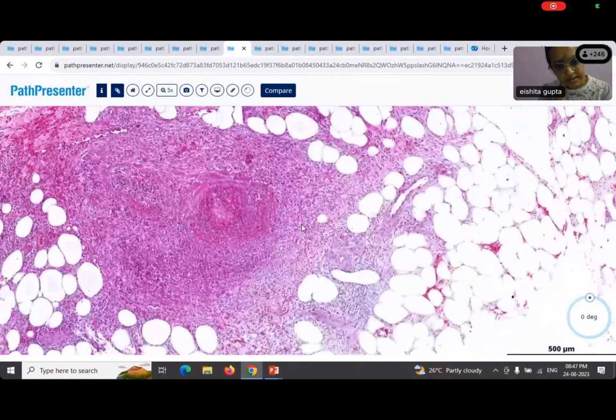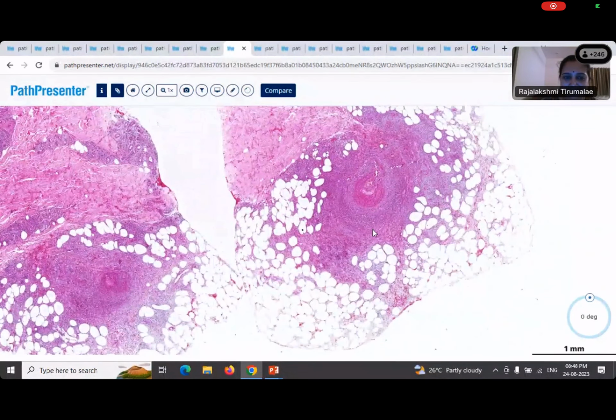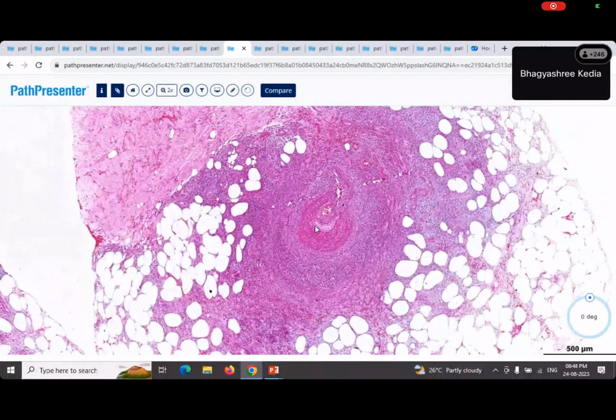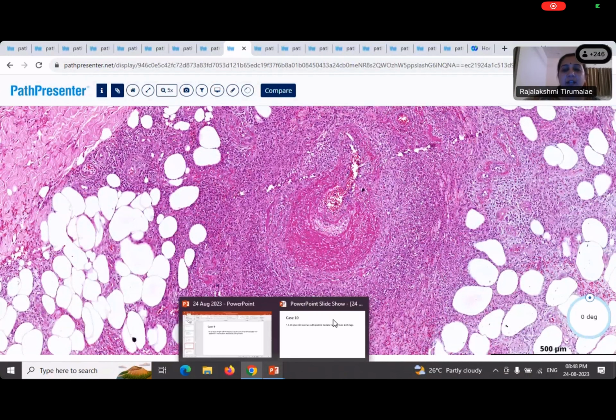Now look at this. This is another cross section that you have. So is it an artery or a vein? That's the most important question that you need to answer, isn't it? An artery. Now, on what basis are you saying it's an artery? You have to justify your choice. Thickened and small. It's not always easy when you have such a dense infiltrate and so much inflammation. You're not seeing the wall. Everything's obliterated. It's a bit difficult to make out artery versus vein.